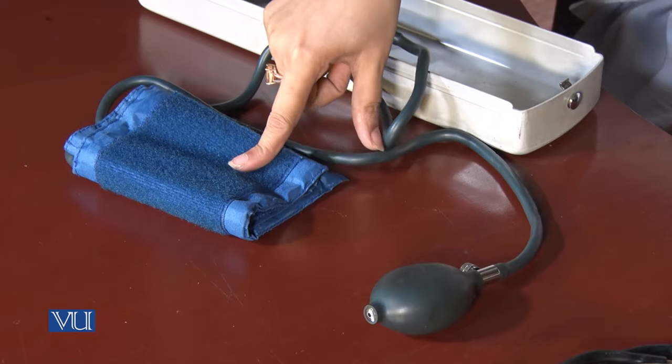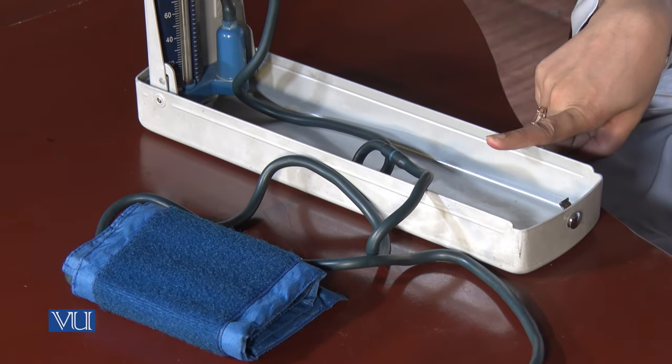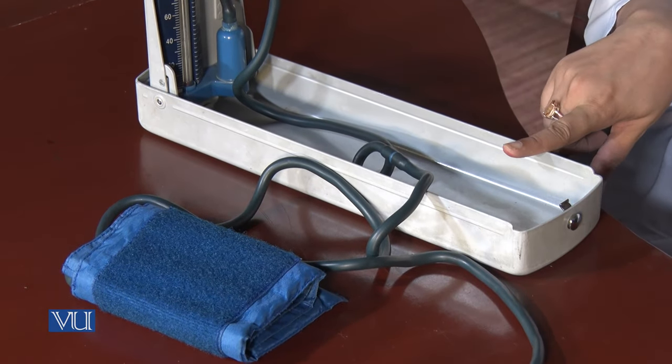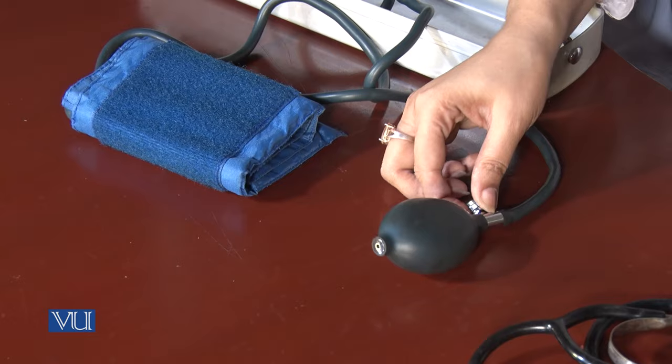To measure blood pressure, we use an instrument called a sphygmomanometer. This device is composed of an inflatable cuff which is wrapped around the arm, a measuring device which indicates the pressure, a bulb to inflate the cuff, and a valve to release the air. We use a stethoscope to listen to the sound of arterial blood flow.